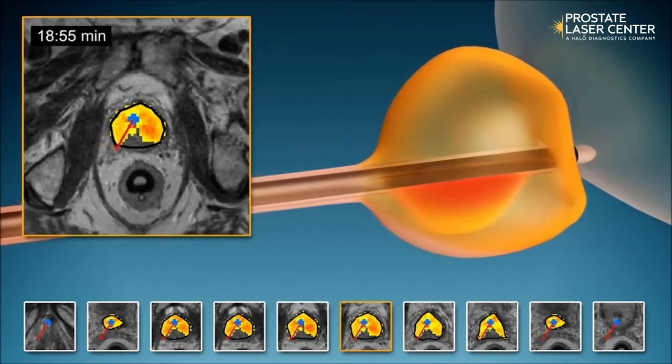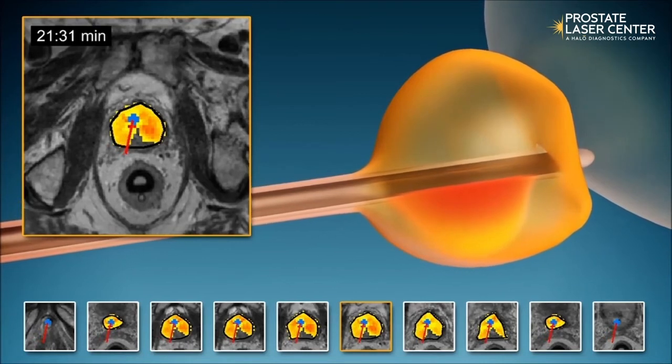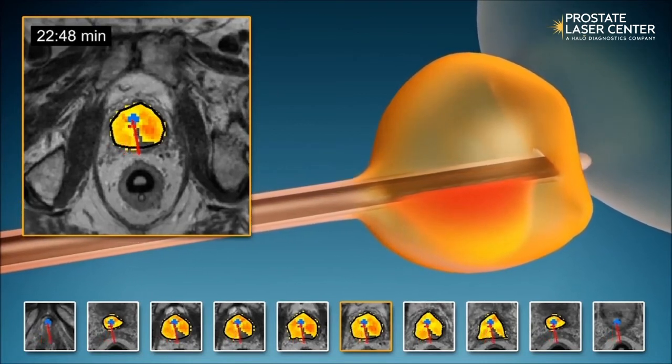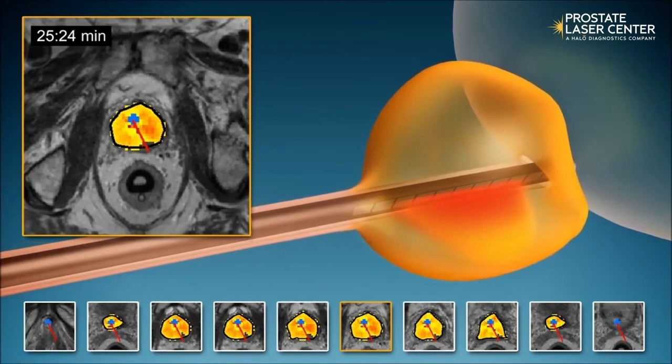The urethra and the rectum are protected by cooling systems. The MRI provides real-time temperature maps to monitor treatment delivery as well as dose estimates throughout the prostate, which we can see an example of here.